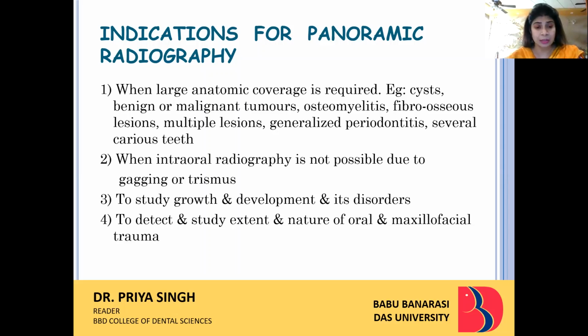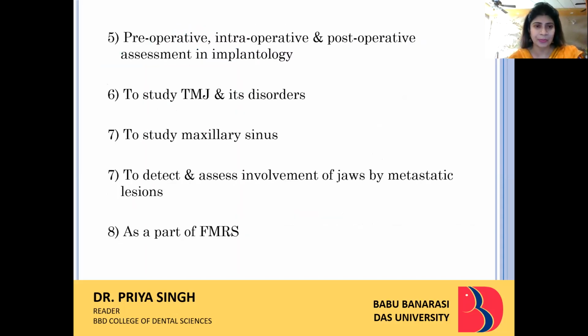Fourth, the most important aspect, is to detect and study the extent and nature of oral and maxillofacial trauma, whether it's Le Fort 1, Le Fort 2, Le Fort 3. Along with other extraoral radiographs, it can be advised to the patient. In preoperative, intraoperative, and postoperative assessment in implantology, it will be very beneficial. In implants, it's very important to assess the amount of bone in an individual.